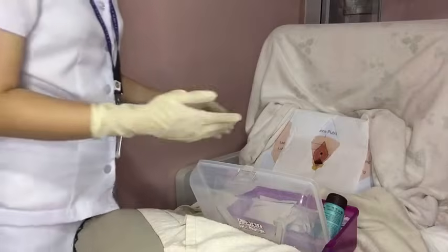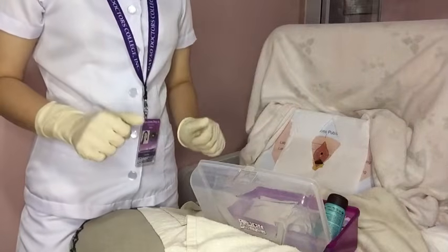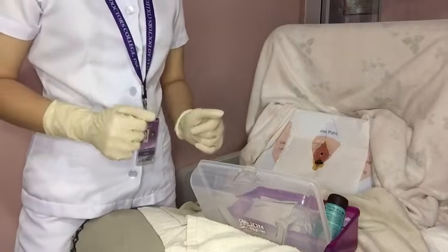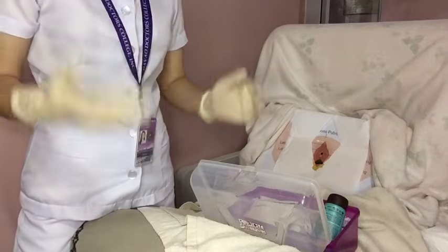Now let's lubricate the catheter about 1.5 inches, being careful not to plug the eye of the catheter. The purpose of the lubricant is to reduce friction.